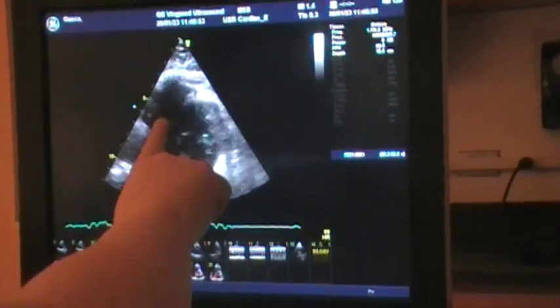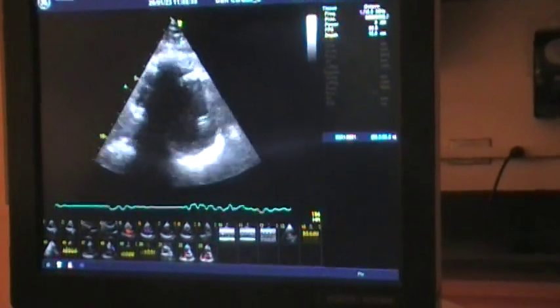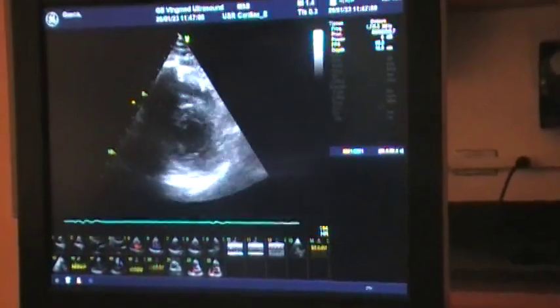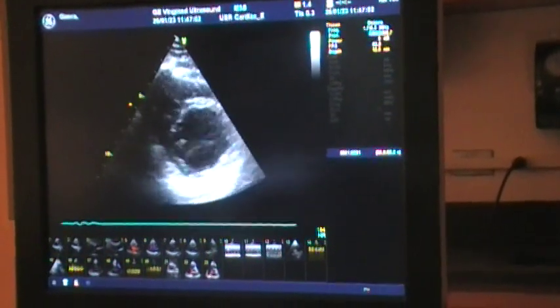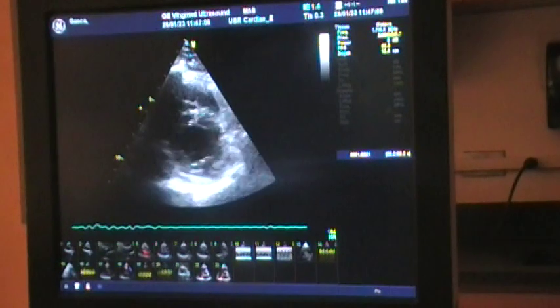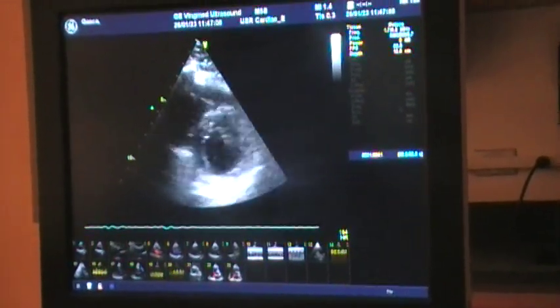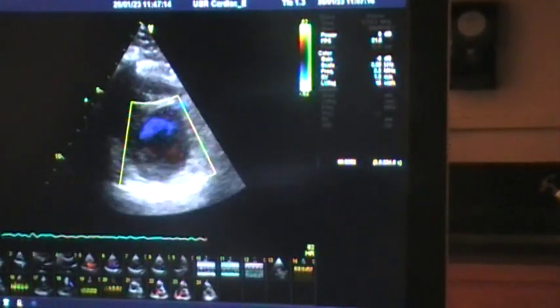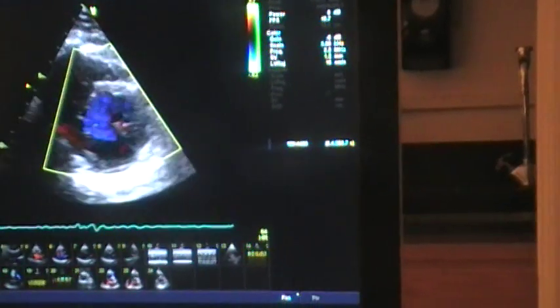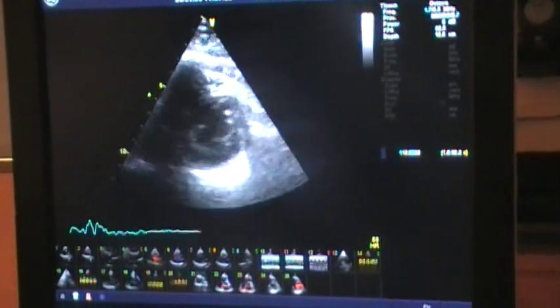Always start at your septum, and that way you have a base to know where you started from and how to go around. So for the mitral level, you're really looking at the wall motion. You want to know, is it all squeezing to the middle equally? And then you're going to capture that. Some places will put color on that mitral valve and on your interventricular septum there, and they'll capture it.